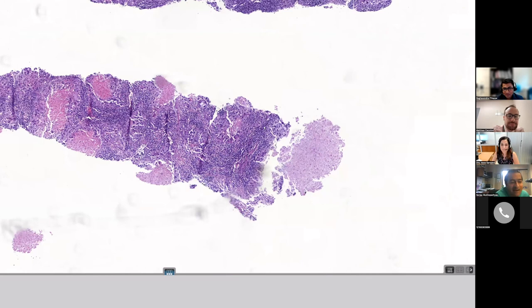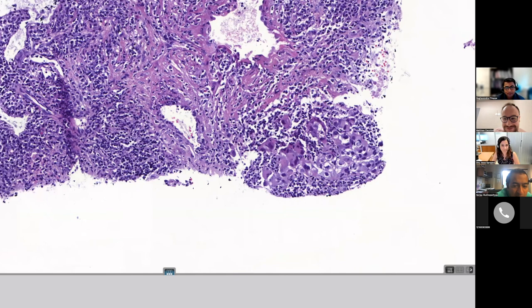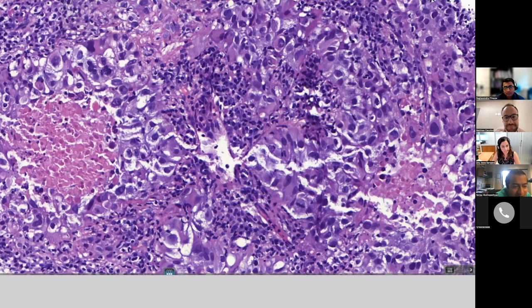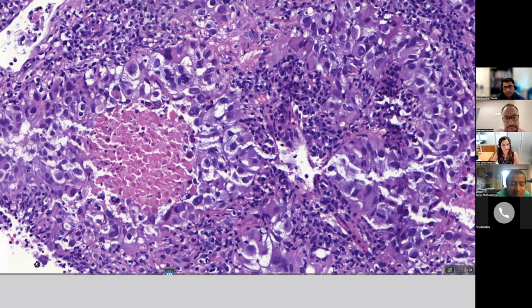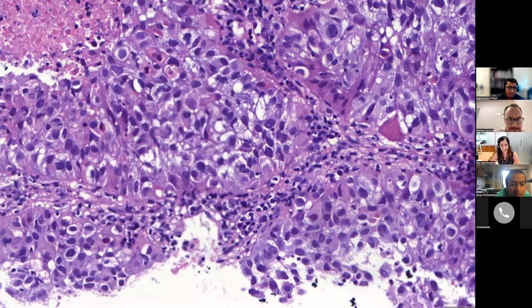Very well said. I think this is clearly malignant, and morphologically it looks very epithelioid and certainly good for carcinoma. Also, if you come down the path of small cell or non-small cell, this is clearly non-small cell. So I would be going down that path unless there's some trick in the history, a previous history of something else or a malignancy in the past. I would be going down the path of a non-small cell carcinoma.